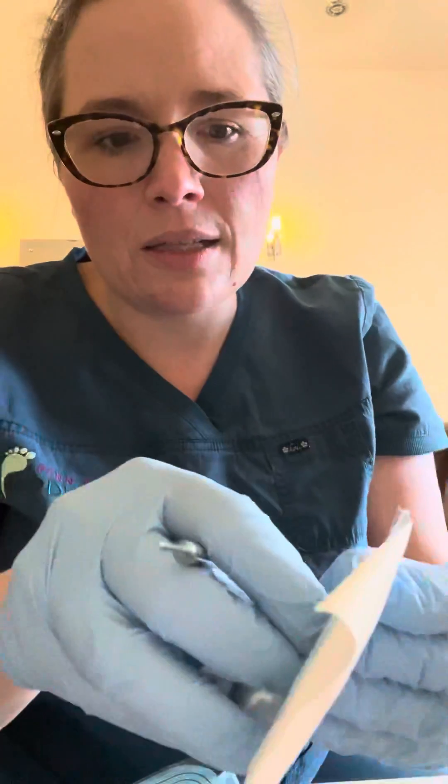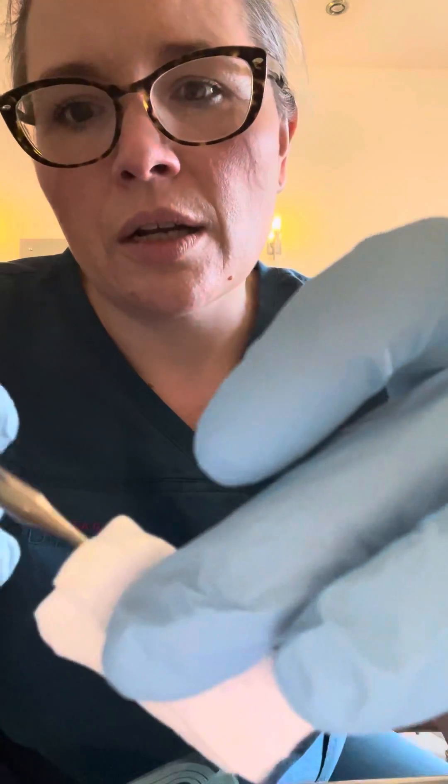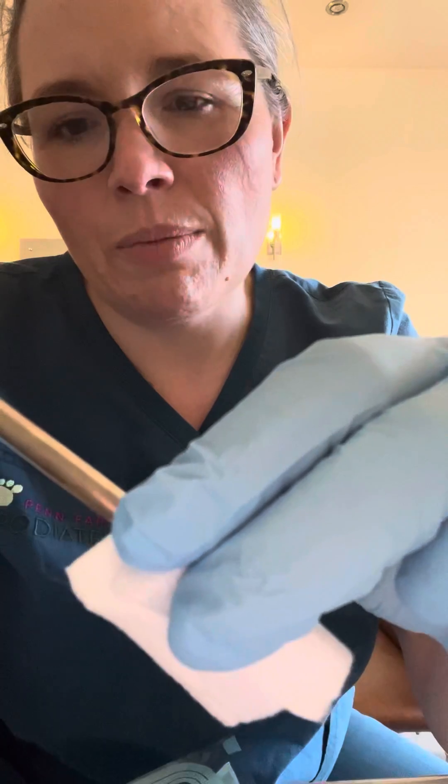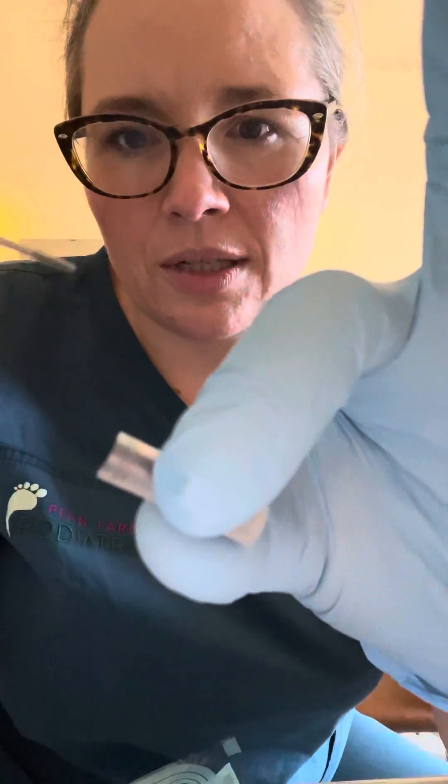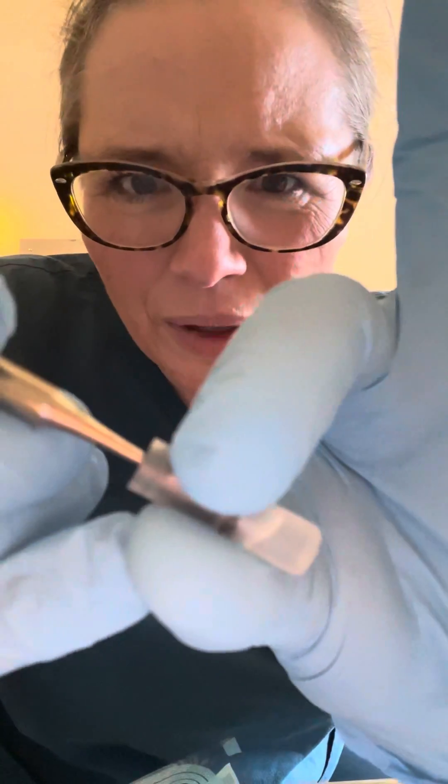All I do is use the black file to push that black bit down. The worry is that it might spill, so I use a bit of gauze and wrap it around just so it doesn't spill out. But just for the sake of the video, I'm going to angle it away from me to get a good picture.